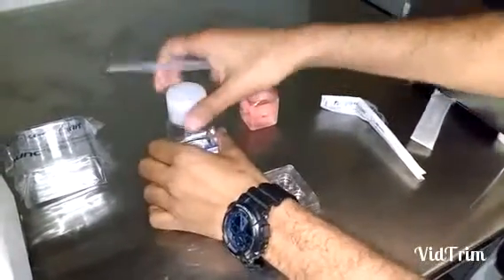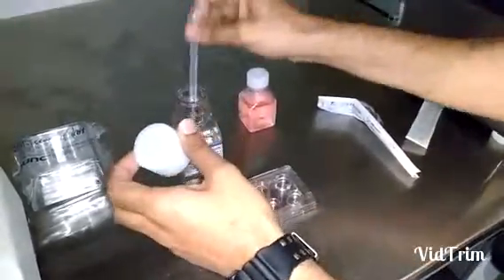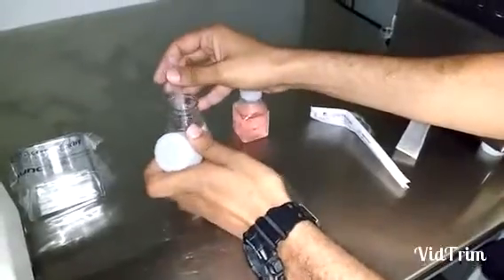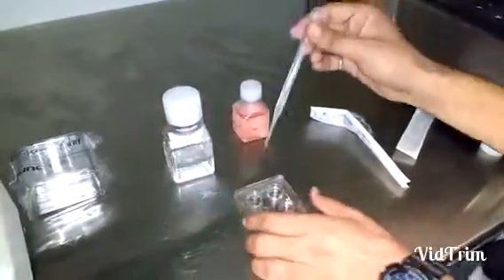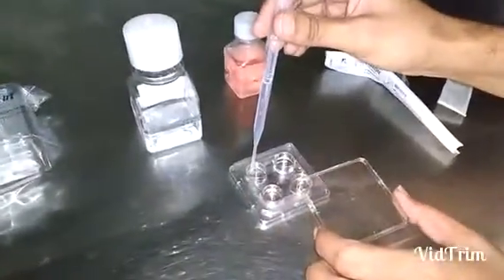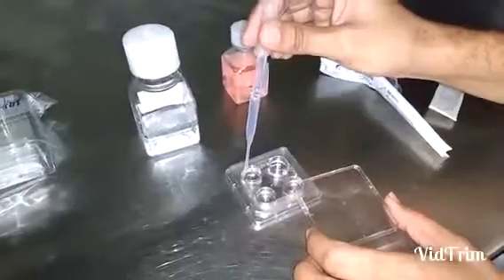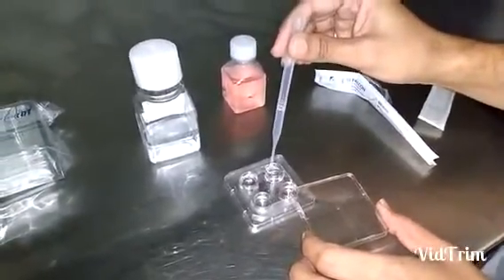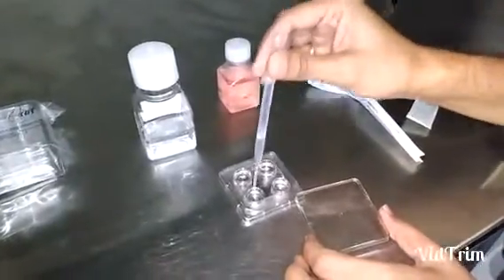And then we overlay the culture medium with oil. Make sure that we put very little oil so that it doesn't come out of the well — we just want to cover the surface.